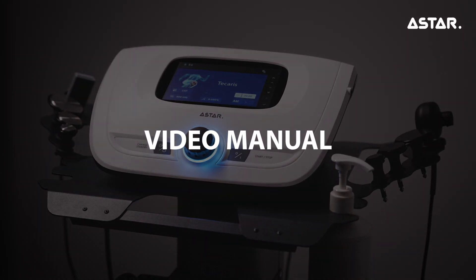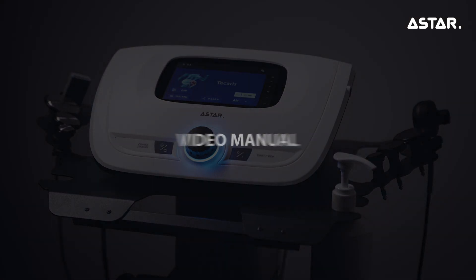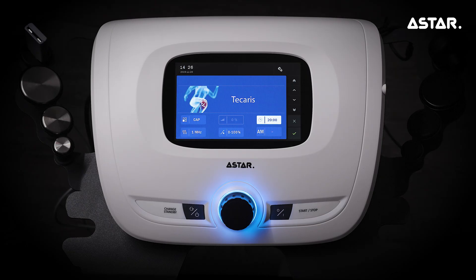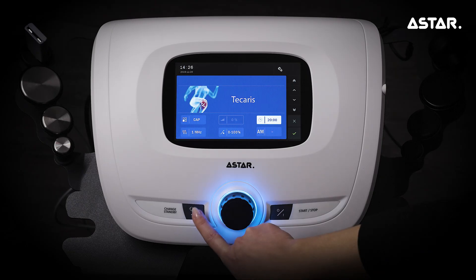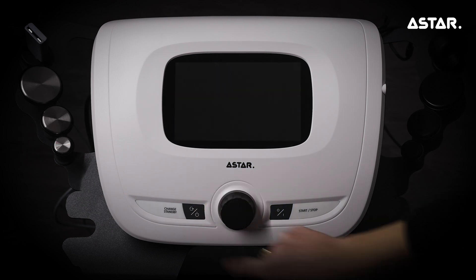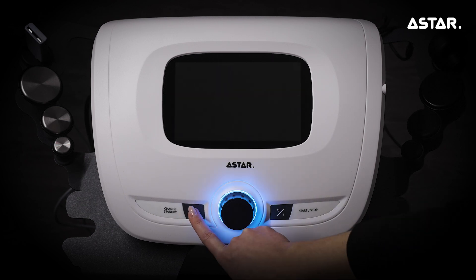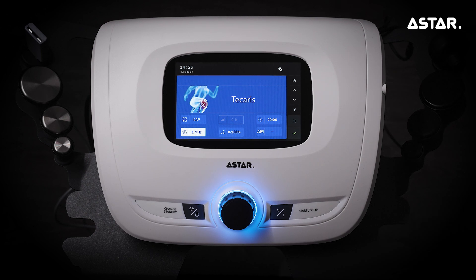Video manual: operation via keys and touch screen. Hold the change standby key for three seconds to blank the display and put the unit into standby mode. Press the change standby key again to restart the unit.